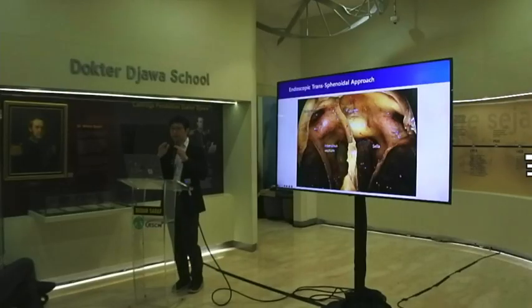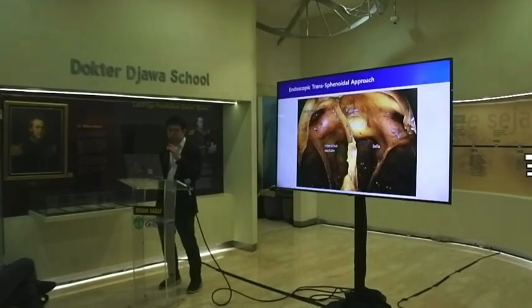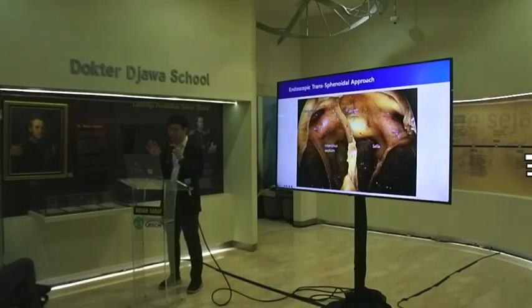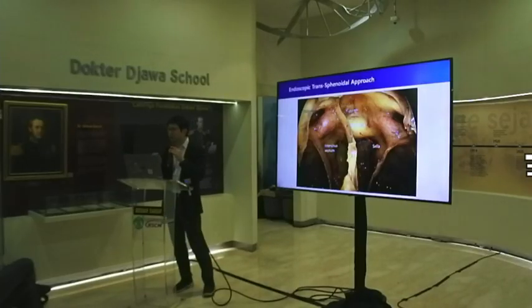After the endonasal phase, you can enter the sphenoid sinus. You can see many anatomical landmarks once the sphenoid septum is drilled out. So always get used to the skull base anatomy and remind yourself of the skull base imaging, which is very important.